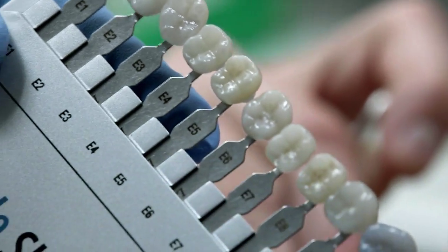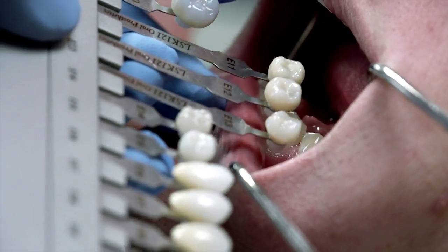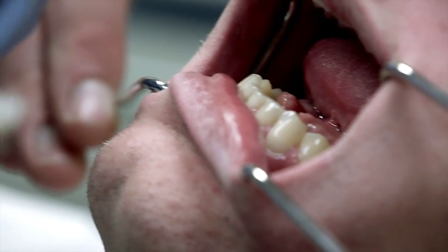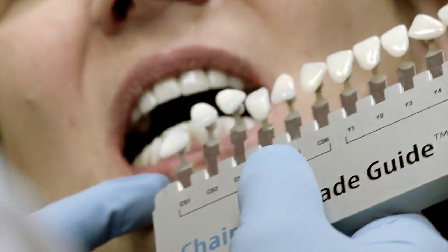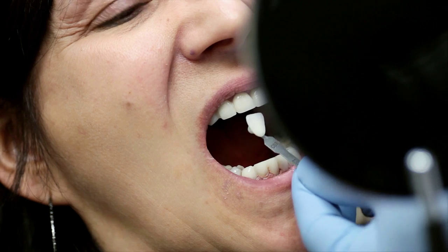Seasons of Life originated as a way to solve the problem of patients who were despondent with their restorative procedures. As the name implies, when the seasons of a person's life change, so does the color of the teeth, the value, the hue, and the chroma. How much money and time have you lost over the years as a direct result of a color being off? How difficult is it to match translucency or mamelon? Has the frustration made you wish for a better system?